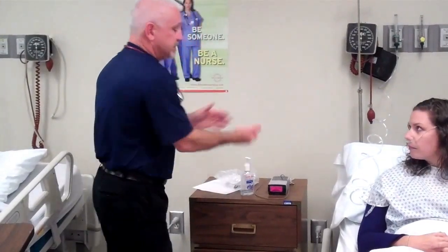Okay? Okay, and at that time, I would go ahead, wash my hands again. I'd leave the room, make sure that there was a no smoking sign posted on the door, oxygen in use, and then I would go ahead and chart.